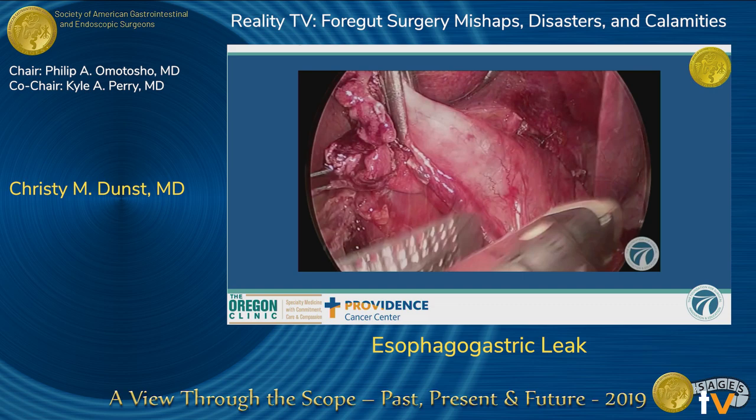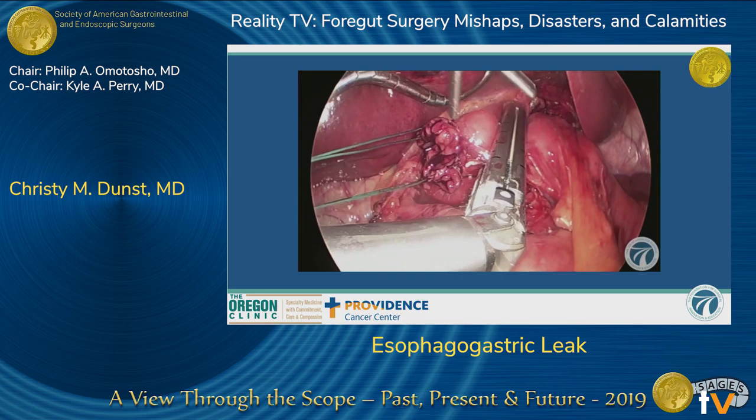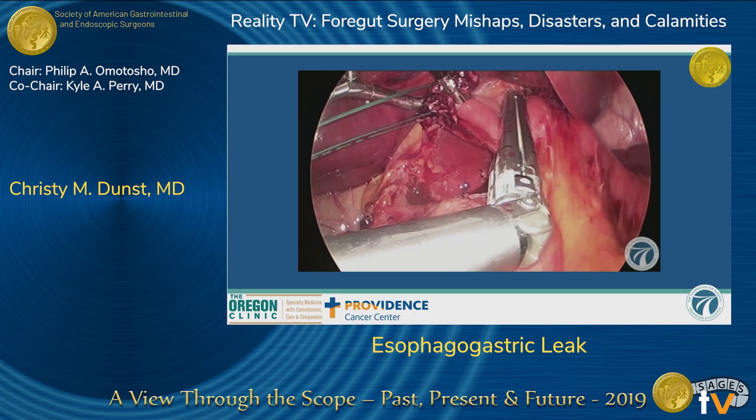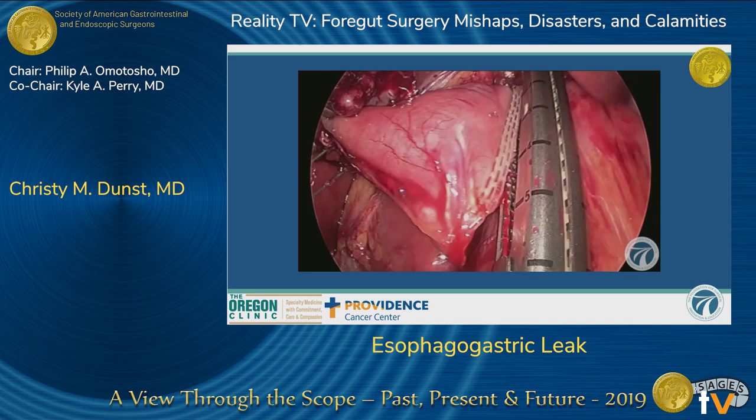Now let's watch this a little bit slower. The video isn't perfect for this detail but bear with me. Here's the stapler going in — I grab the end to sort of maximize my angle. I like it to be really close, like nothing between the staple lines. It's pretty close.